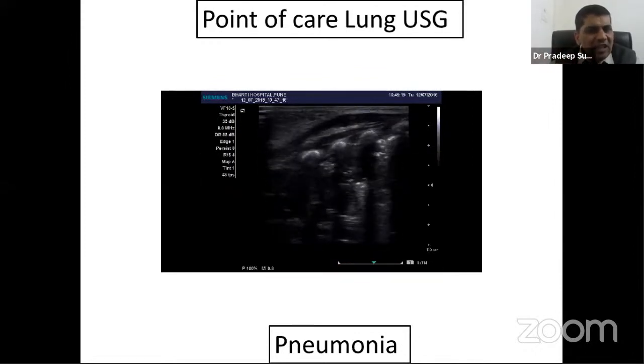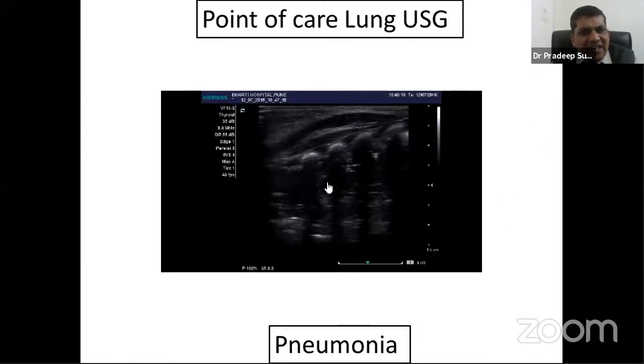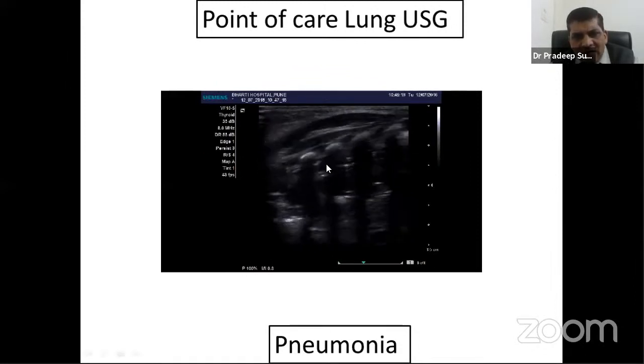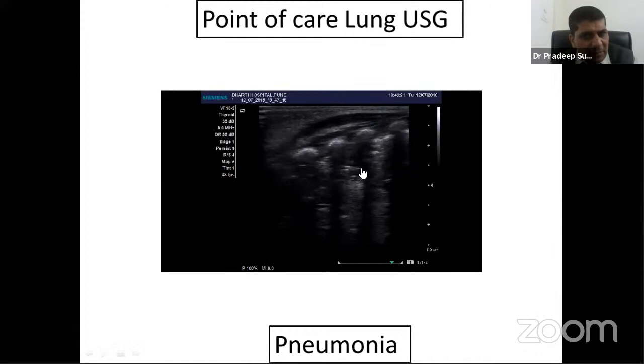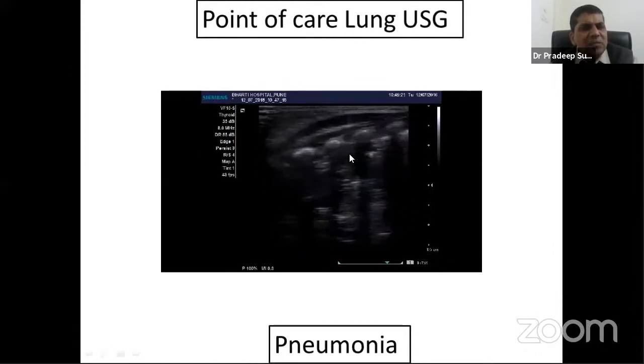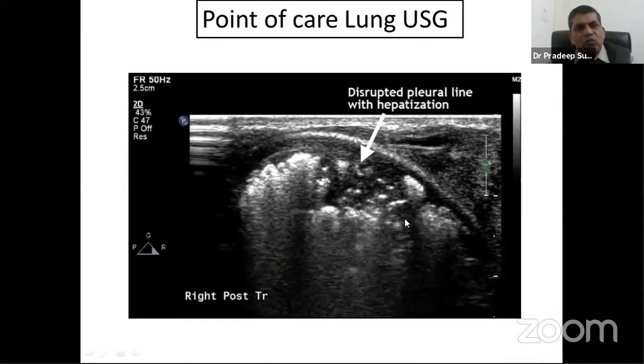In this baby, we also did the lung ultrasound. This lung ultrasound is classic, with the Shred sign, classic of synpneumonic effusion. You can see a little bit of effusion also, and this is hepatization of the lung. So this lung ultrasound indicated this baby has pneumonia, a bad pneumonia. This is the classic picture of hepatization with synpneumonic effusion and Shred sign on lung ultrasound, which we'll cover when the lung ultrasound discussion comes.